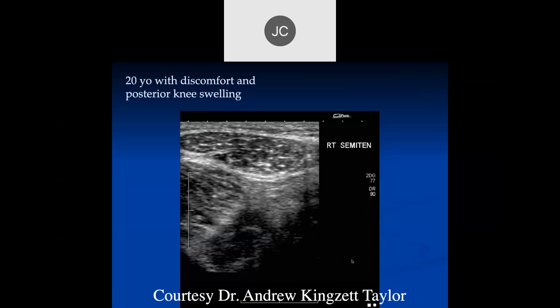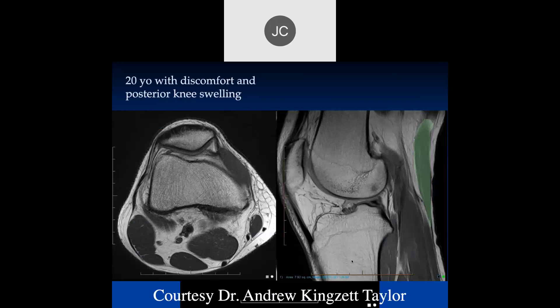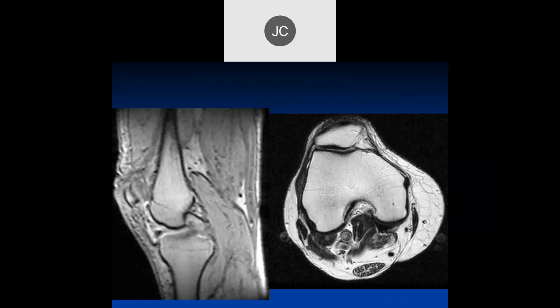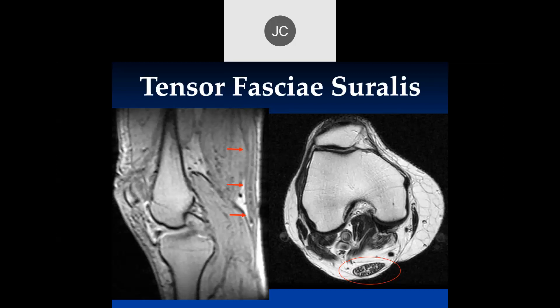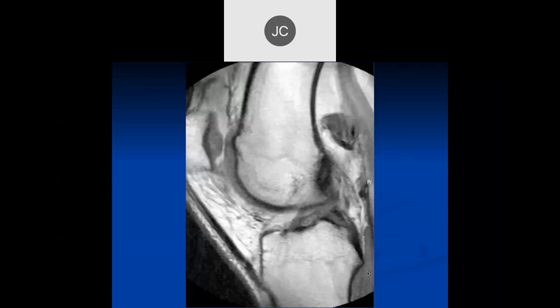It's important to differentiate pathologic from normal variants. It may be embedded into the posterior fascia to help differentiate. On the next case — sagittal and coronal of the knee — there's something similar: an accessory muscle coming down into the fascia, with a little bit of fatty atrophy. This is another tensor fasciae suralis muscle.